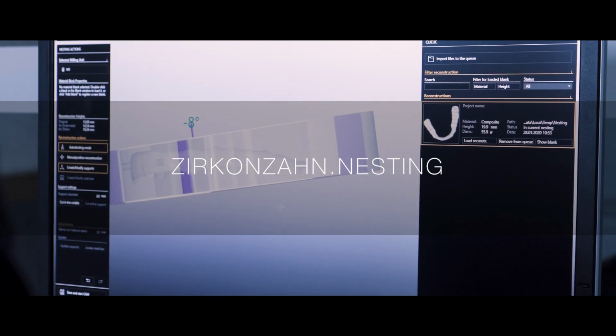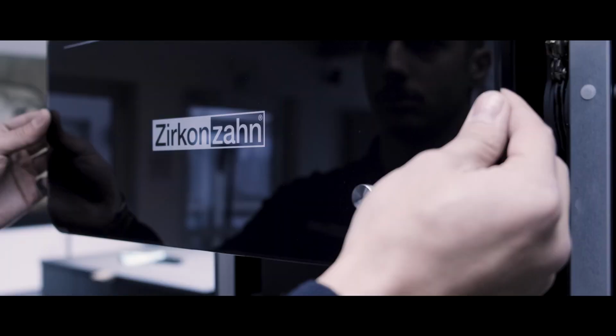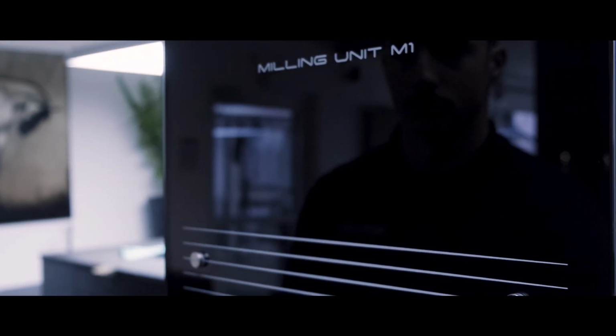In the Zirkonzahn Nesting software, we place the virtual restoration in a material blank and start the milling. As a material, we use Therapon Transpa, which is ideal for making bite splints and surgical guides, and then we mill the prototype in the M1 Wet Heavy Metal milling unit.